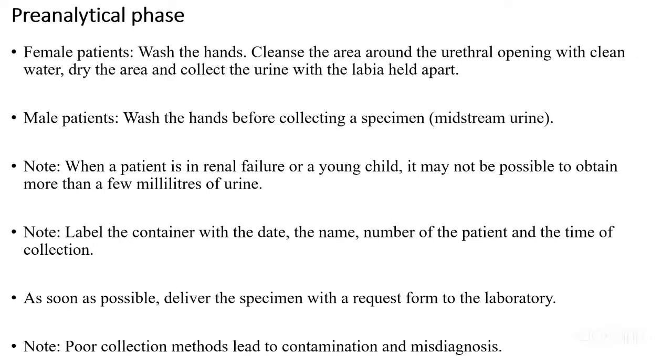Also in the pre-analytical phase, for female patients, advise them to wash their hands before collecting the urine. Then they should clean the area around the perineum, the area around the urethra opening, with water, so that you can remove most of the bacteria and the normal flora around that part. Then allow it to dry and collect the urine with the labia held apart. Here, you'll also remind them to collect the midstream urine. For male patients, they wash their hands before collecting the specimen and are instructed on the midstream urine.